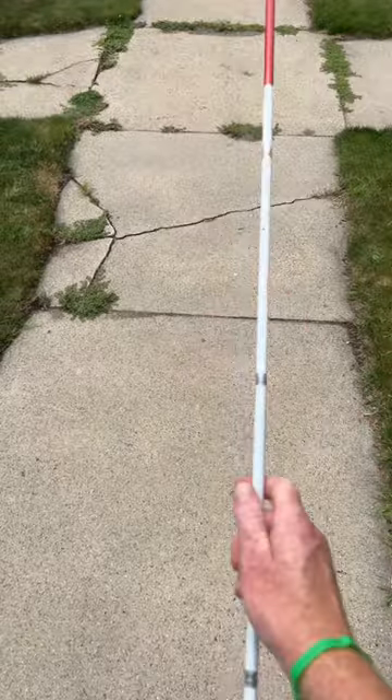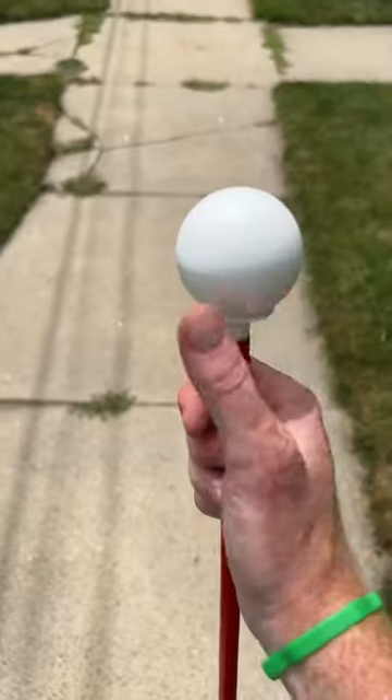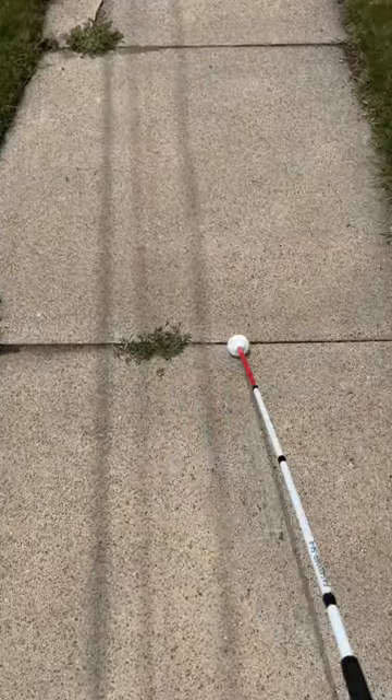This one here is a pencil cane tip. This one is a rollerball cane tip. And then finally, here we have a jumbo roller cane tip.